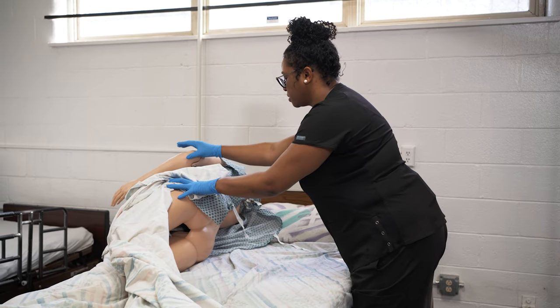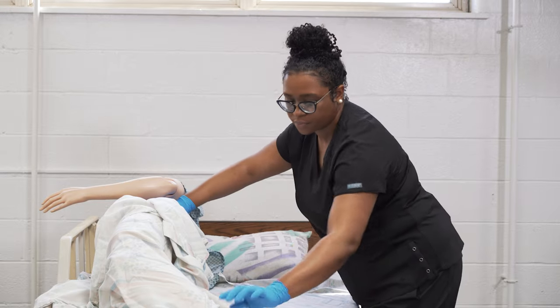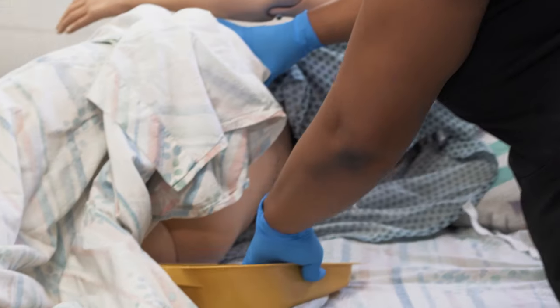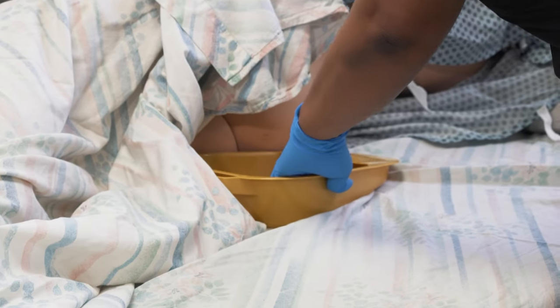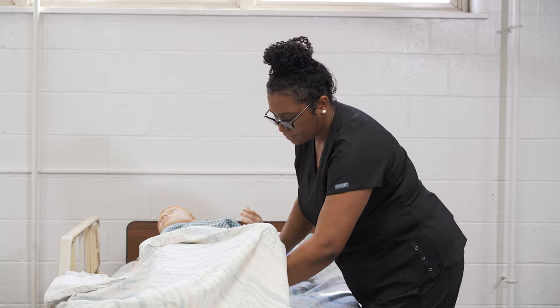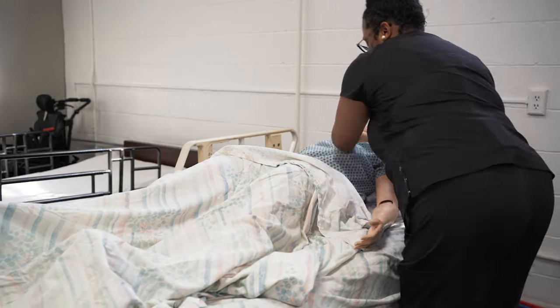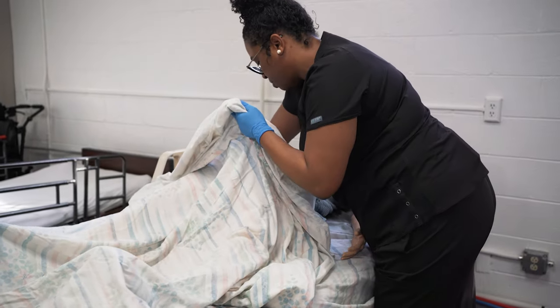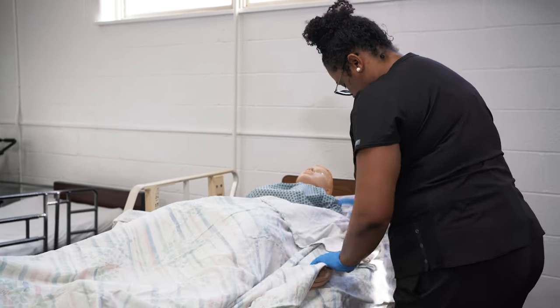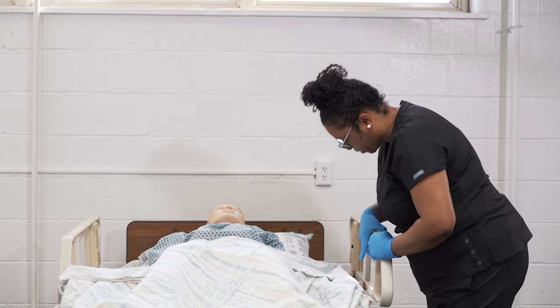Only expose the body parts needed to place the resident onto the bed pan. Make sure that the flat side of the fracture pan goes towards the resident's head. As you move the resident back onto the bed pan, on the count of three — one, two, three. Then always check for proper positioning and make sure the resident is comfortable. Check the position of the bed pan. Then raise your side rail back up. Ms. Smith, I'm going to raise the head of your bed.